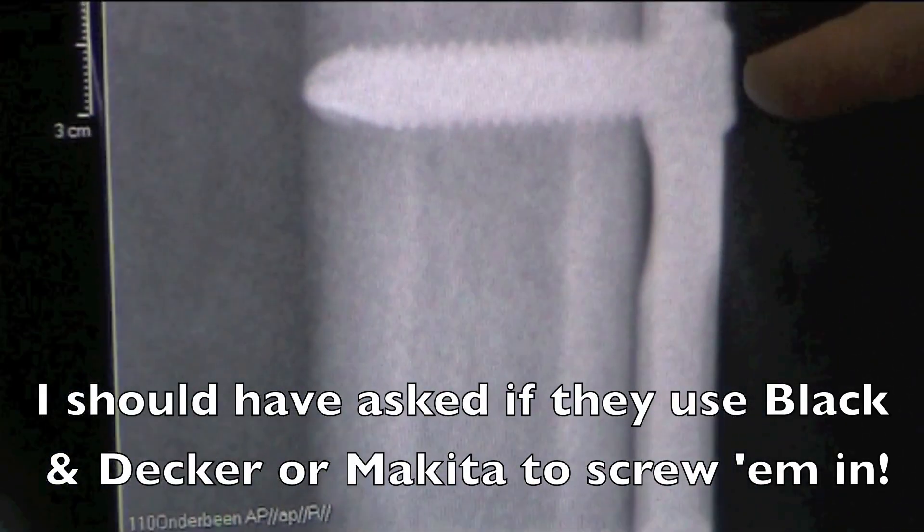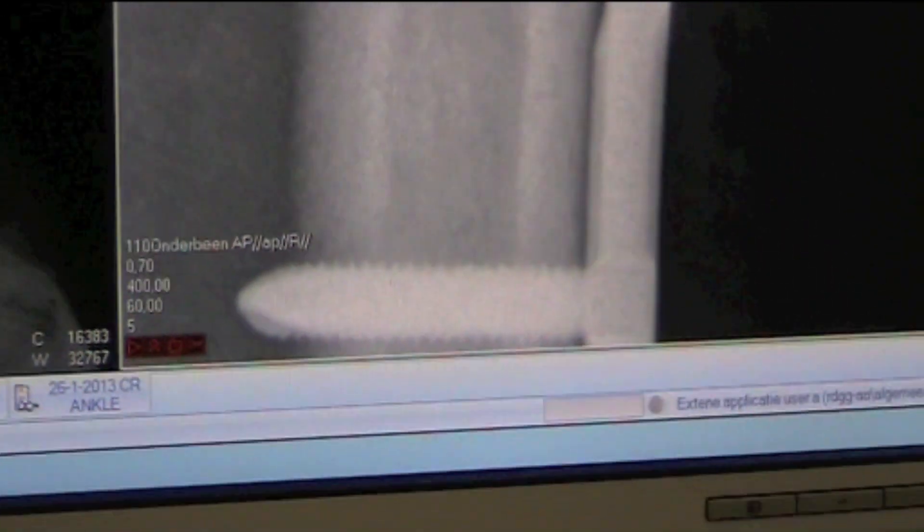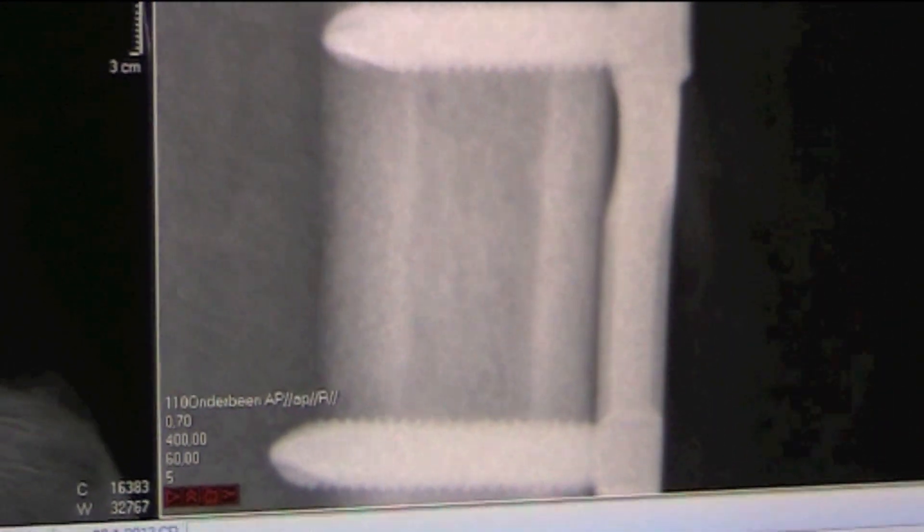Sometimes people ask me, aren't your screws too long? Actually, that was a question I had. But it's normal — it's supposed to be long because it has to touch two cortices.